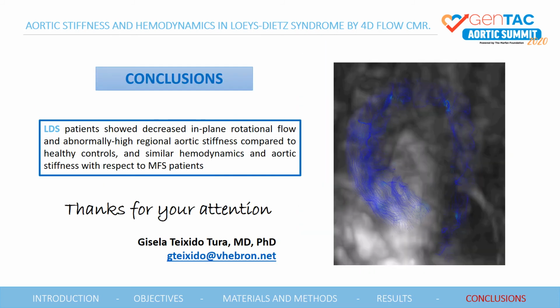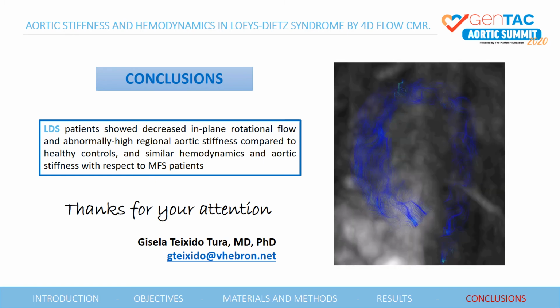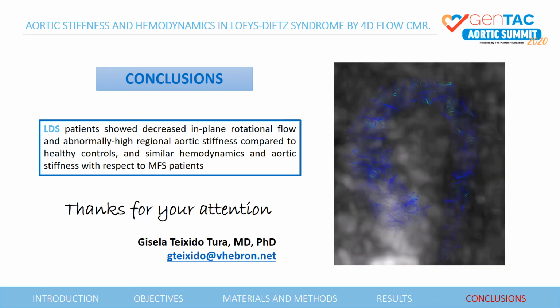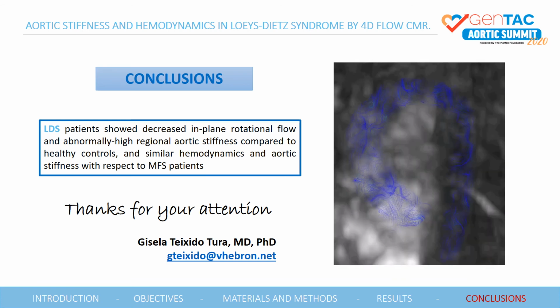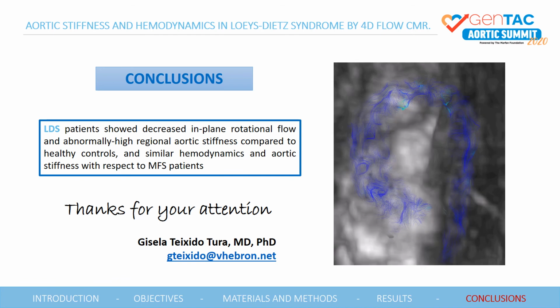In conclusion, Loeys-Dietz patients showed decreased in-plane rotational flow and abnormally high regional aortic stiffness compared to healthy controls, and similar hemodynamics and aortic stiffness with respect to Marfan patients.